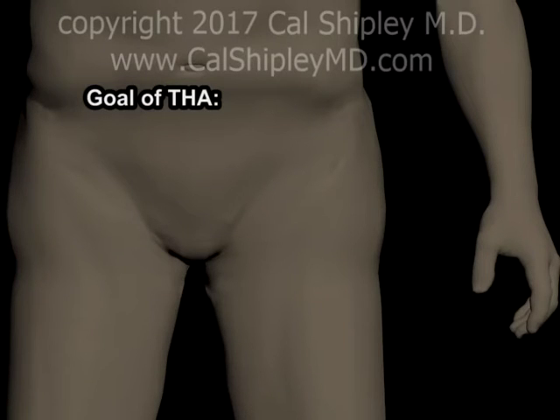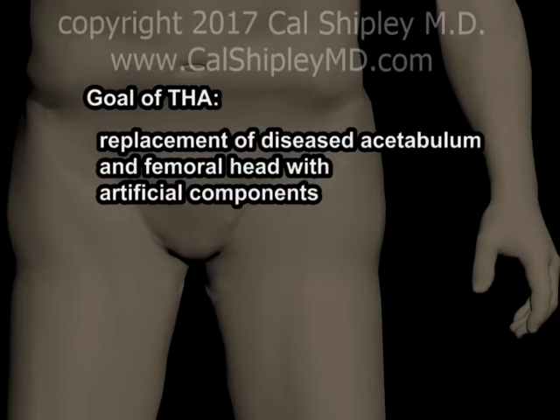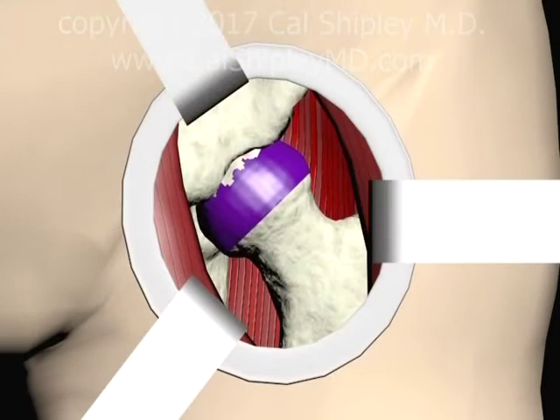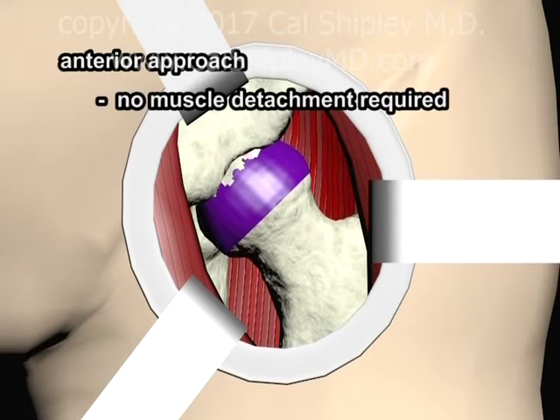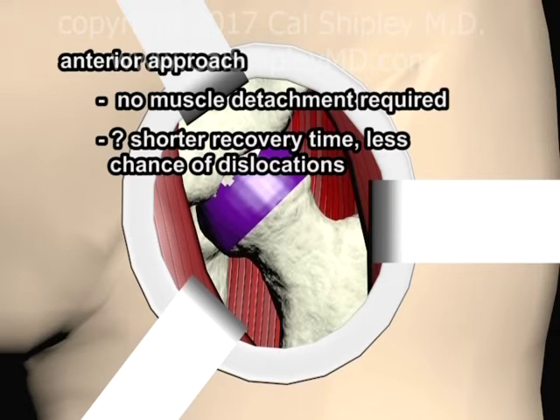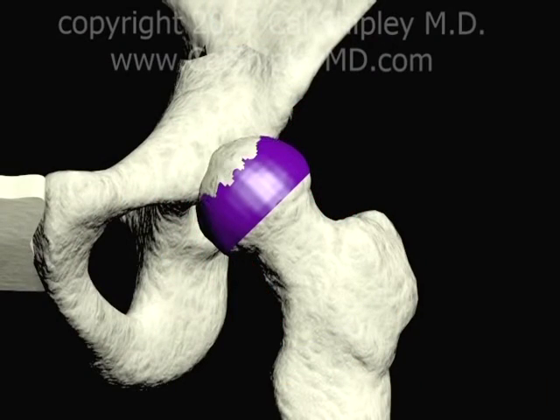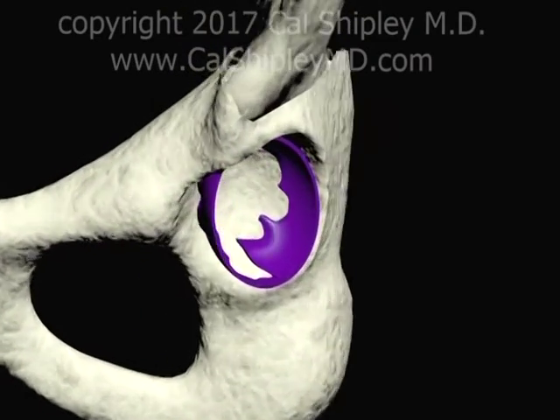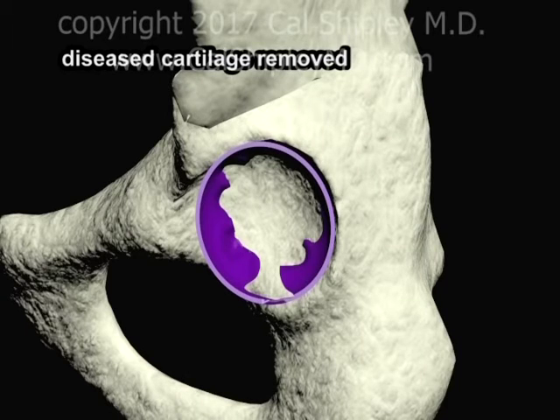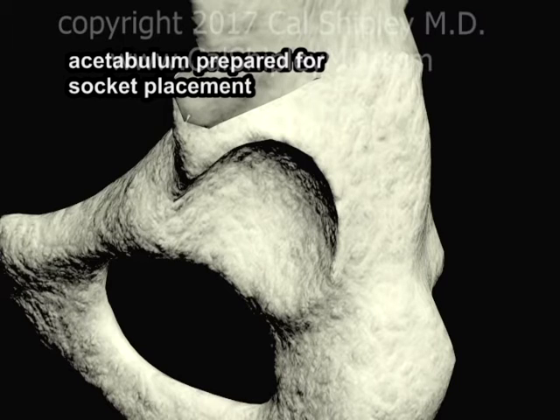While there are different techniques and approaches preferred by different surgeons, the goal of all THA procedures is replacement of the diseased acetabulum and femoral head with artificial components. For the purposes of this review, I am going to depict the so-called anterior approach, whereby the hip joint is entered from the front of the patient. One advantage of the anterior approach is that it does not require detachment of any of the muscles around the hip joint. Some studies indicate that this approach is associated with a more rapid recovery and a reduced chance of dislocations postoperatively. The next step is to dislocate the head of the femur in order to permit access to the acetabulum. The diseased cartilage in the acetabulum is then removed, and the bone of the acetabulum is surgically prepared for placement of an artificial socket.